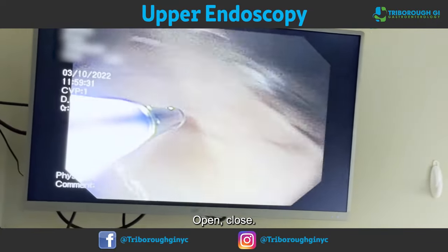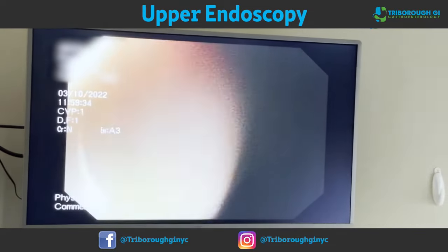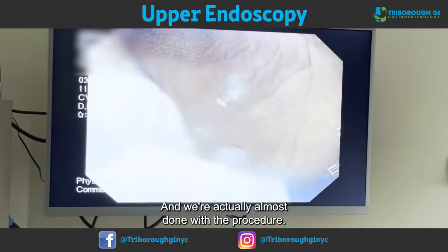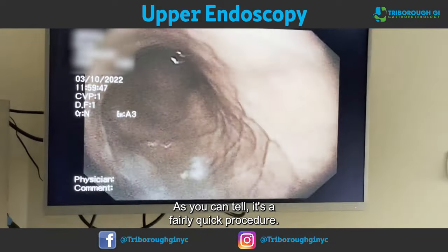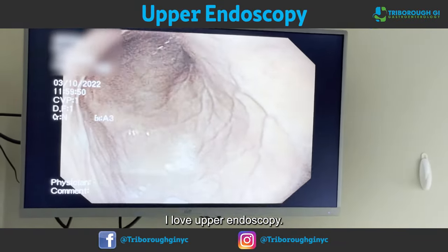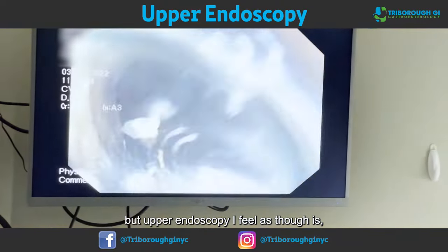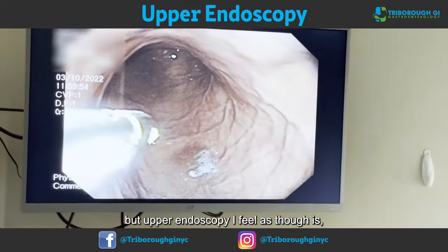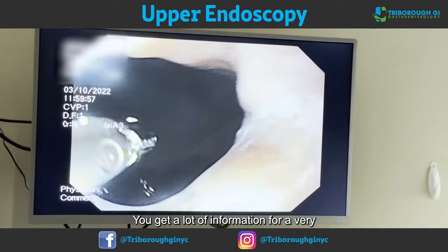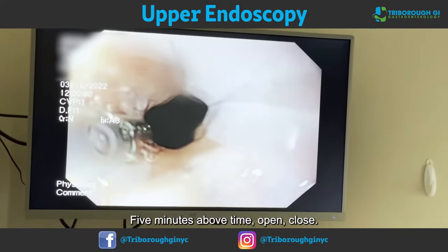Here we circle back to the body of the stomach. We inspect everything — looking at the mucosa, or the lining of the stomach, to make sure everything looks great, and it does. Open, close — get a little sample. We're actually almost done with the procedure. It's a fairly quick procedure and you get a lot of information out of it. Upper endoscopy gives you a lot of information for a very cheap price, so to speak.